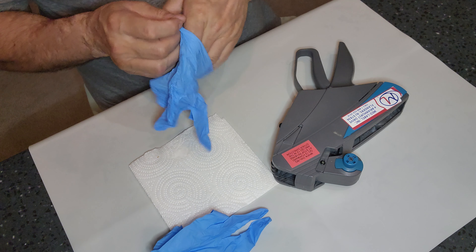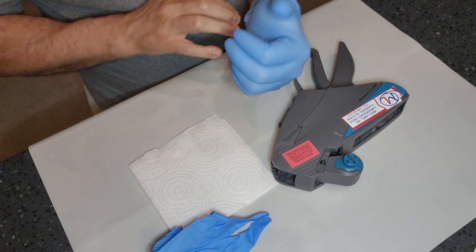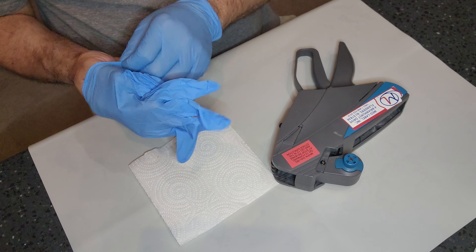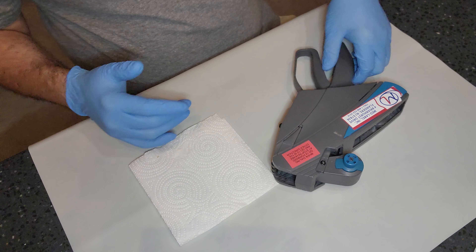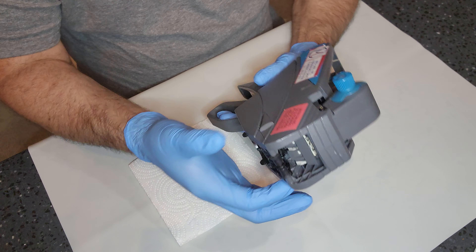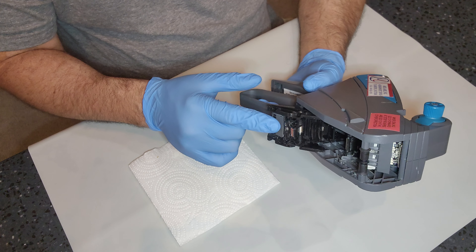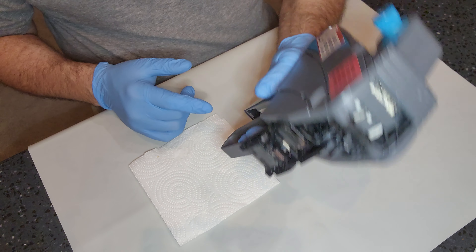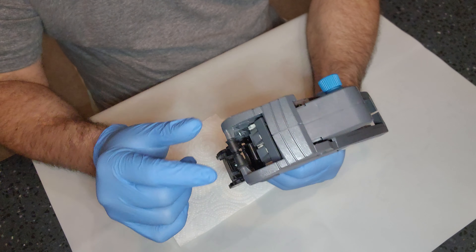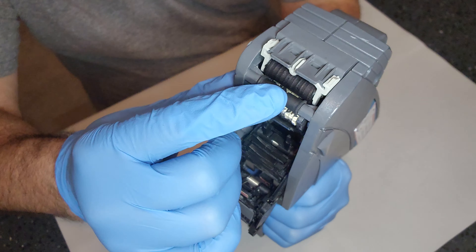First things first, go ahead and put your gloves on. Then you want to open up the housing door for your sticker gun — those little latches right there on the side. Once that latch door is open, press your trigger until the ink roll appears right on the top. See where that ink roll is? That right there is the ink roll.